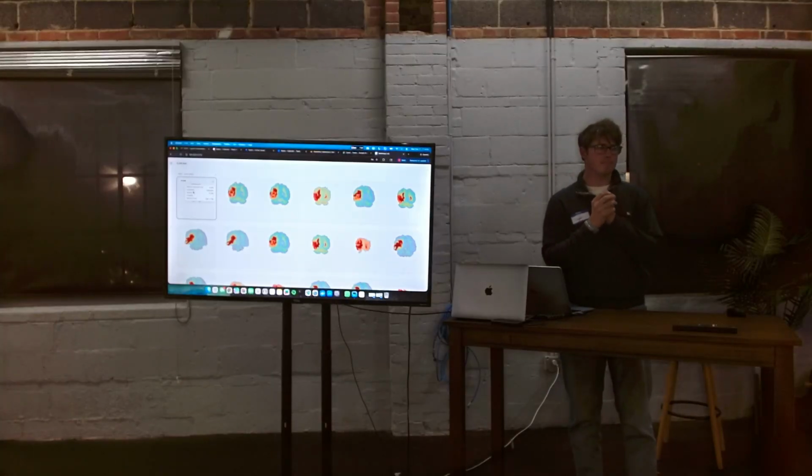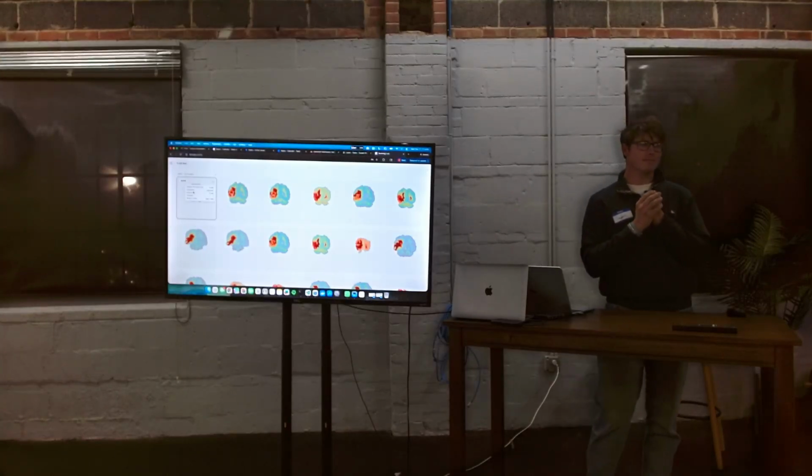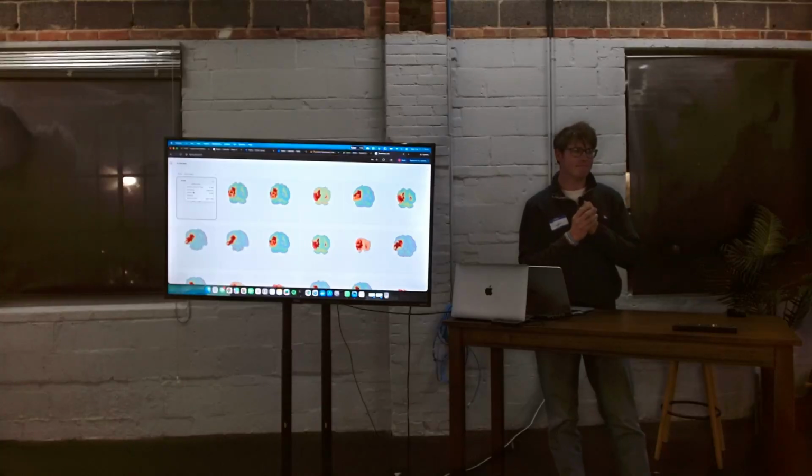So your intent will be to sell this eventually, if you develop this for a hospital setting where a cardiologist can use it on his different scans, the real-time data, or maybe for spleen measurements? I'm not sure if it measures the spleen, but does that, and real-time data has been fed into it. Is that what the intent is?